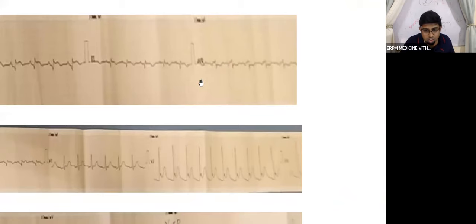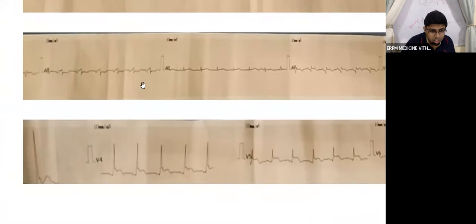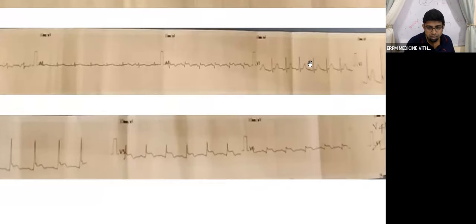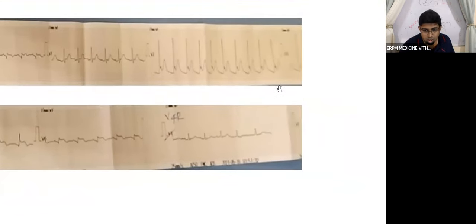This is your aVR. And this is your aVL, and this is your aVF. This is your V1, this is your V2. This is your V3.